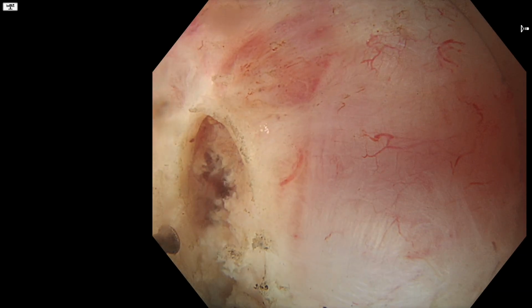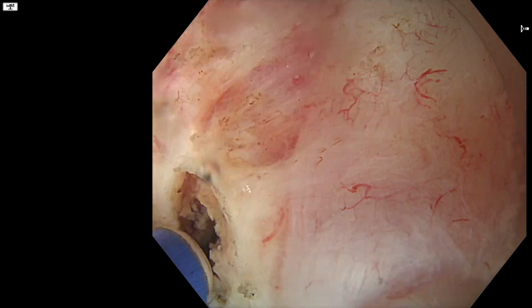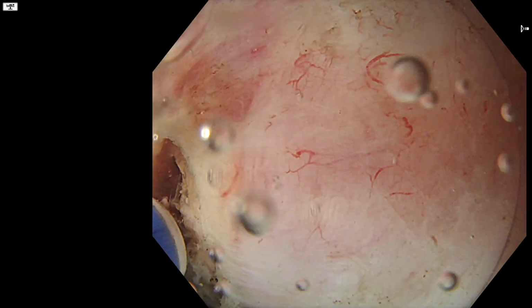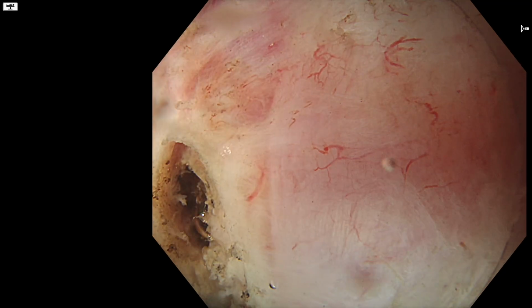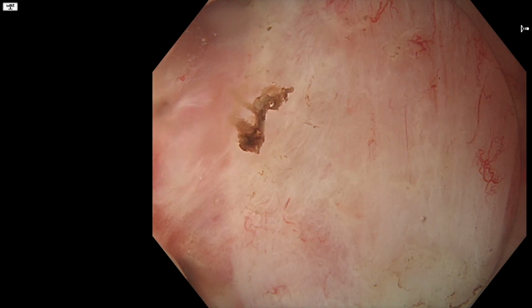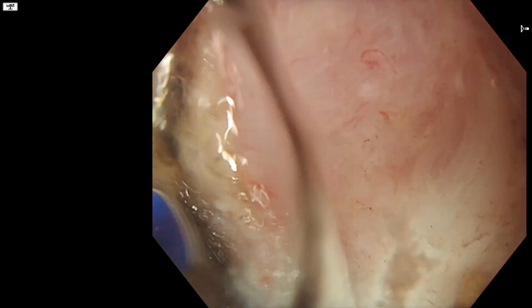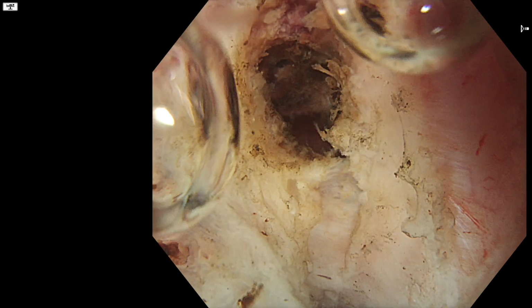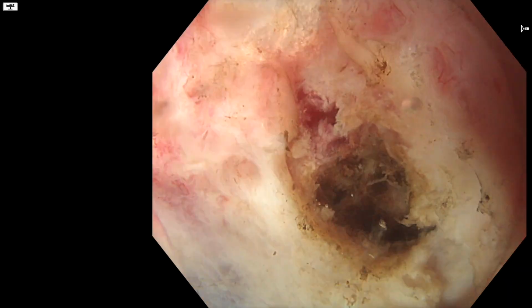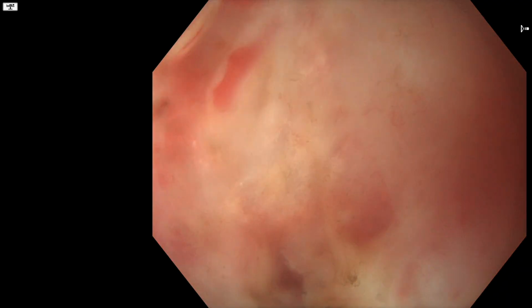I'm seeing some blood coming through there, as you can see, so I'm trying to coagulate it. But then I realized that's probably just the fluid that's coming in from the other side. So here's where things start going downhill. I decide to continue on the side, but I hit a vessel and start to bleed. Now I'm trying to tamponade with the cap, but that tears an even bigger hole into the specimen here, and you can see the vessel up top there.